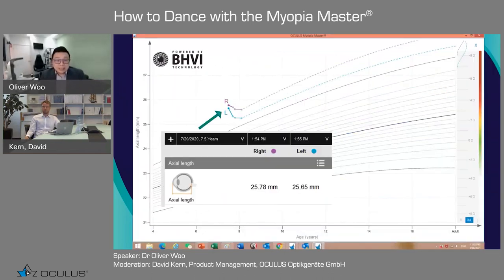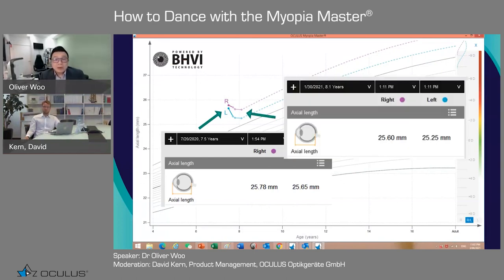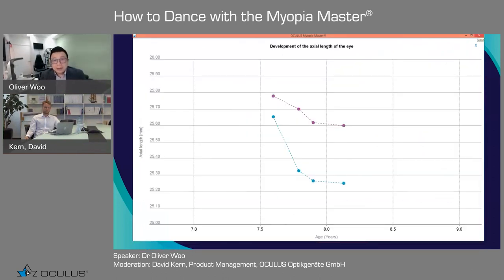So we can see this is how we started and how it is after 5 months of ortho-K for the myopia management. So a chart can tell the parents and they can visualize, we can make the right decision, we execute the right things for the kids' future.